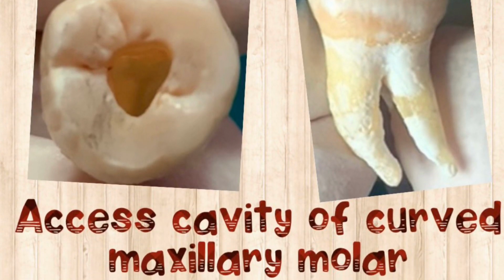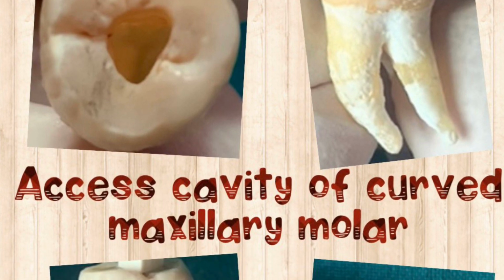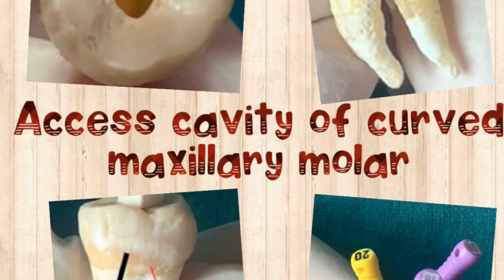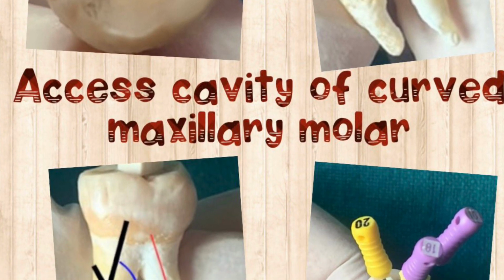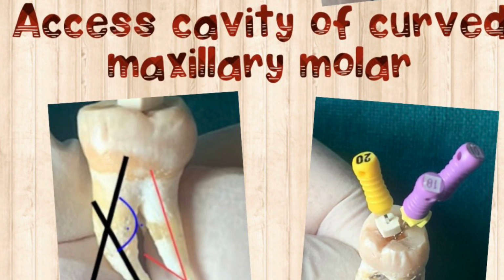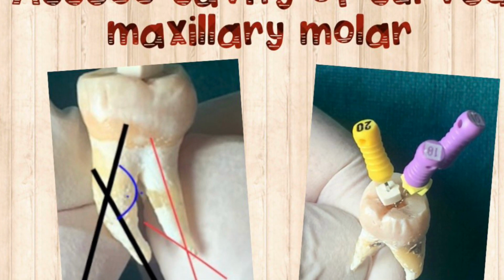This video is a tutorial of making access cavity in a maxillary molar. Now the specimen that we took has curved roots, so we'll also be able to discuss how to approach such a situation. Now let's go ahead and watch.